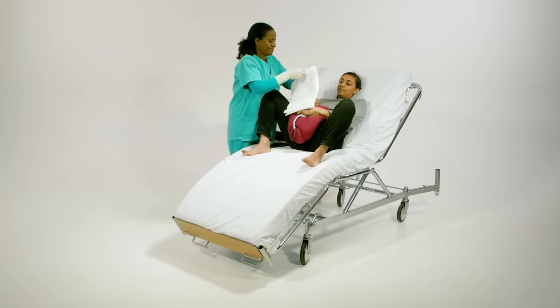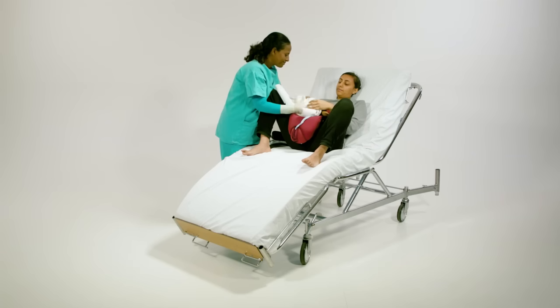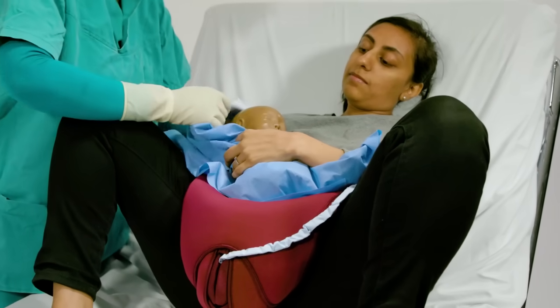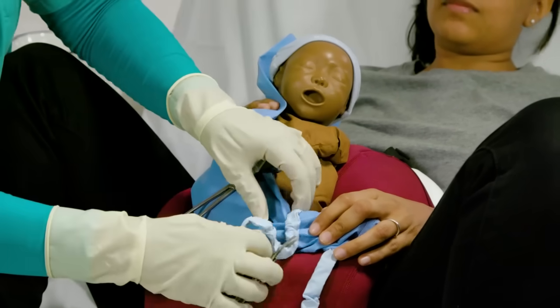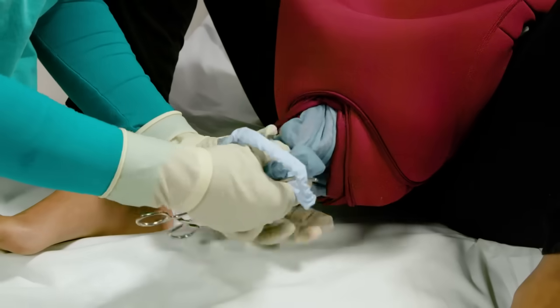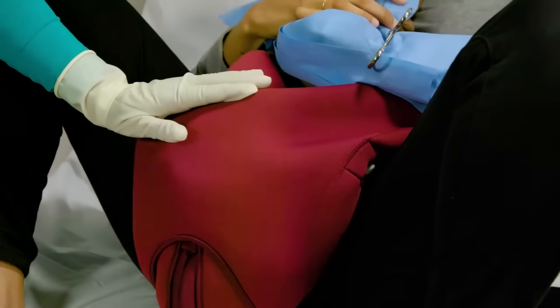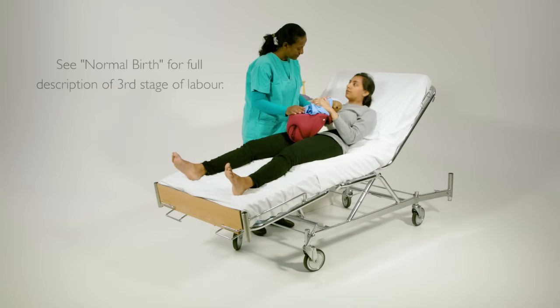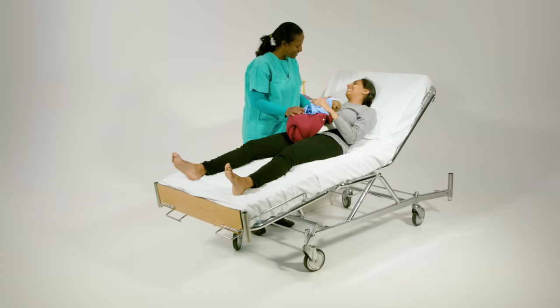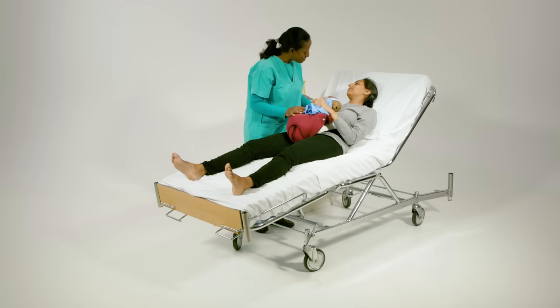Place baby Berthi on the Mama Berthi abdomen and dry before clamping the cord. Provide routine care for the mother and baby during the third stage of labour. Babies born with shoulder dystocia are at increased risk for needing resuscitation and should be closely observed after birth.